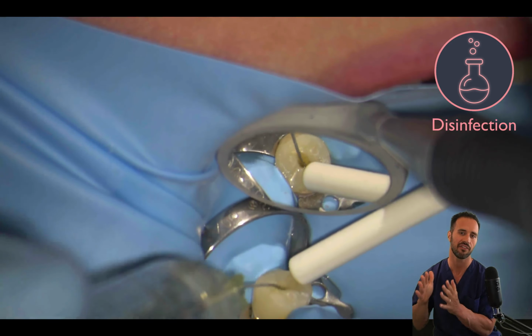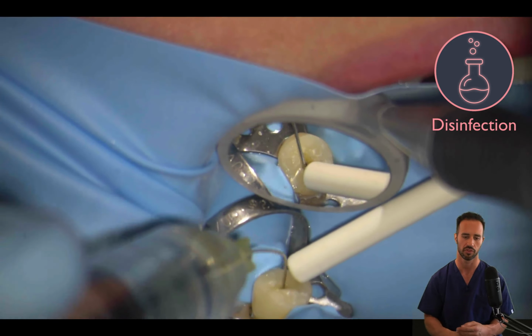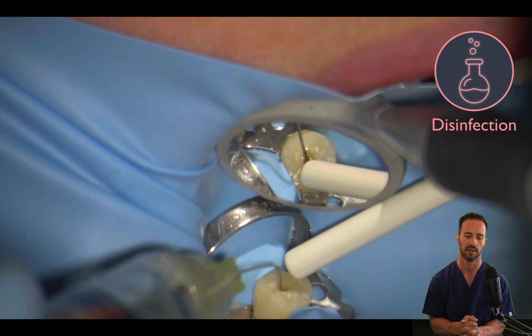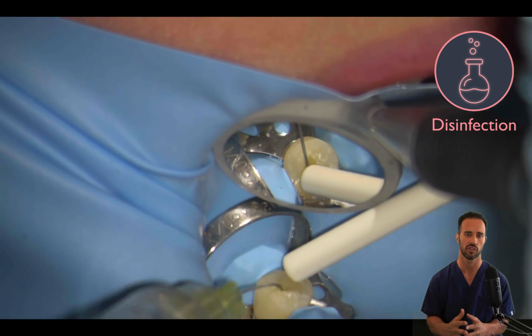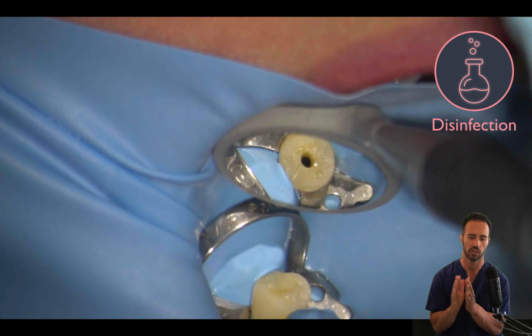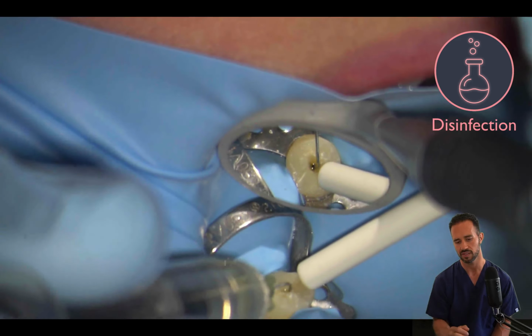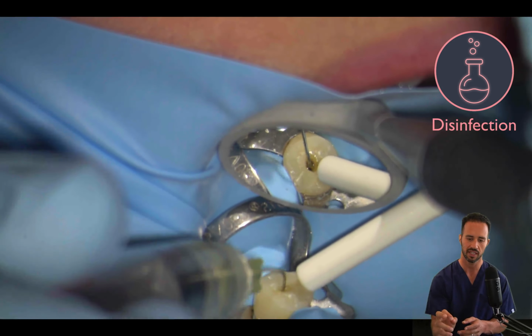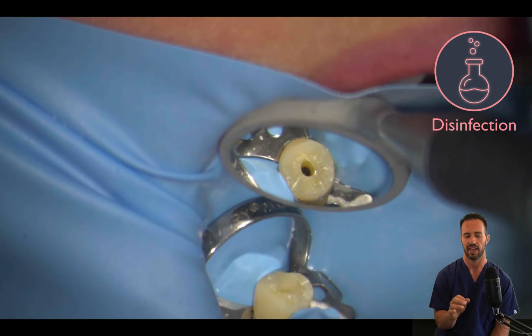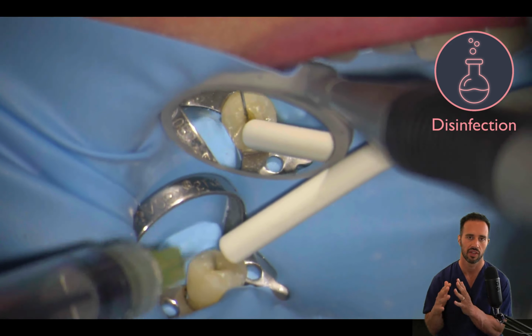So this is now the disinfection stage of our case, where we're going to pass a lot of sodium hypochlorite through the tooth. Okay, don't be shy about passing, like I mentioned, between 10 and 20 milliliters of sodium hypochlorite through a case. I would encourage you to do that, especially for necrotic cases. So now we're aspirating out after we've done our initial bout of sodium hypochlorite, and we're introducing our 17% EDTA rinse. You don't need a whole lot of this, but you want to stick it in there, pass that through, let it soak for a little bit, and then you're going to aspirate out and go back with our final rinse with the half-strength sodium hypochlorite.